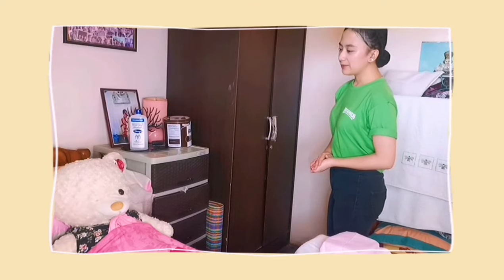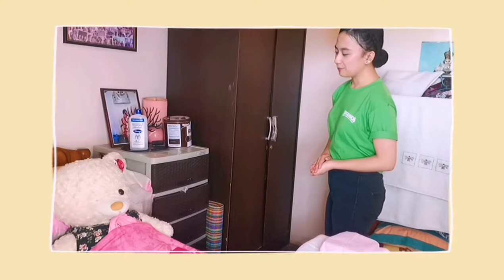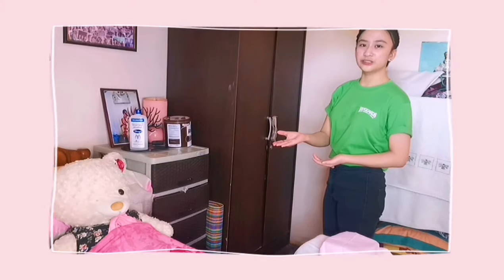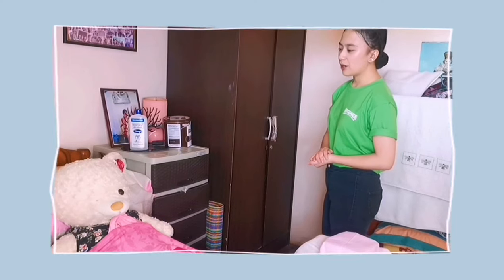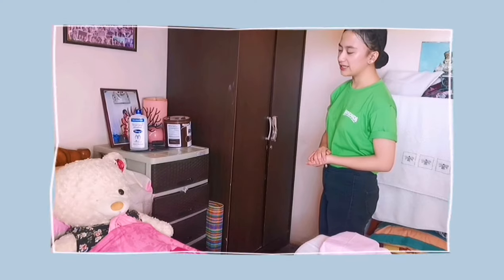Good morning ma'am, my name is Roxanne, I am your nurse for today. You can call me Nurse Rox or San. May I know your name ma'am? Okay, Mrs. Max, please. And then I explain the procedure to the patient: So today ma'am, I will be doing Foley catheterization. It means I will be inserting a sterile tube into your bladder to drain your urine. Is it okay ma'am?